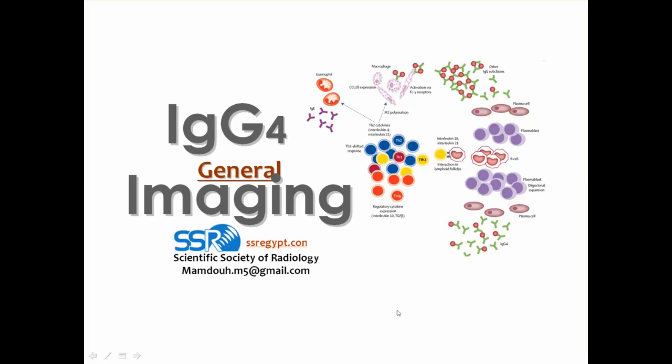Dear colleagues, now we will discuss a new topic, which is one of the recently discussed topics in the clinical practice, especially in the radiology practice, and this is what is known as IgG4 related diseases.